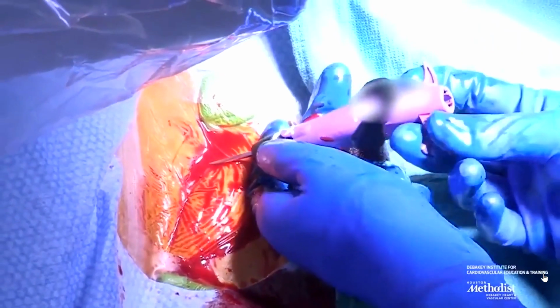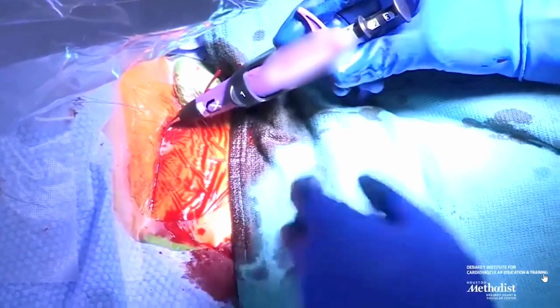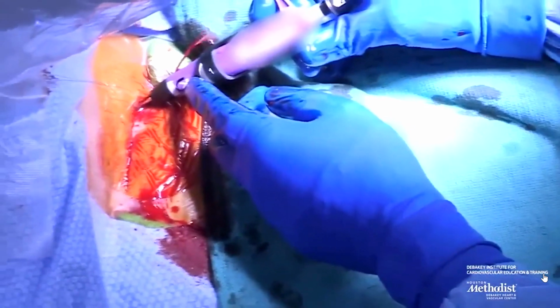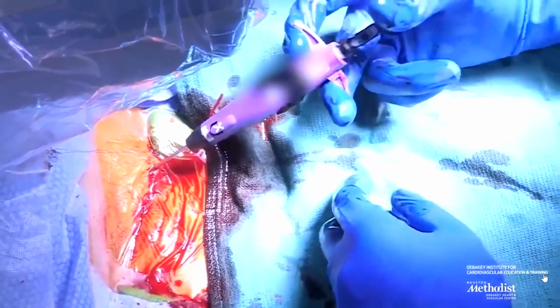When you place 2, you do it at 2 o'clock and 10 o'clock if you're looking at the artery in a cross-sectional view. Then you retrieve those little sutures that you're seeing there, and you tape them. We put the J wire back again, and then that's the second ProGlide going in. You can see how there's brisk blood coming out. You put the foot plate up, and then you pull. That means we're up against the wall of the artery. Then you deploy it, and you cut the sutures.